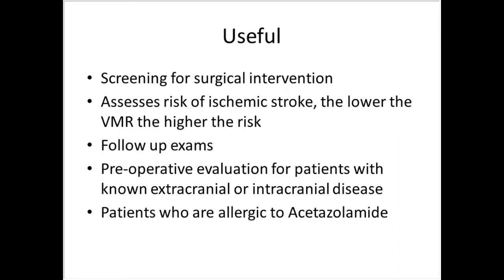So we feel that vasomotor reactivity testing is useful for screening for surgical intervention. It assesses the risk of ischemic stroke because the lower the VMR, the higher the risk of stroke. It's very useful for follow-up exams.